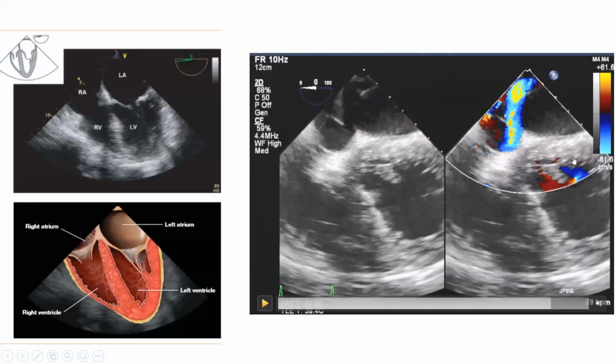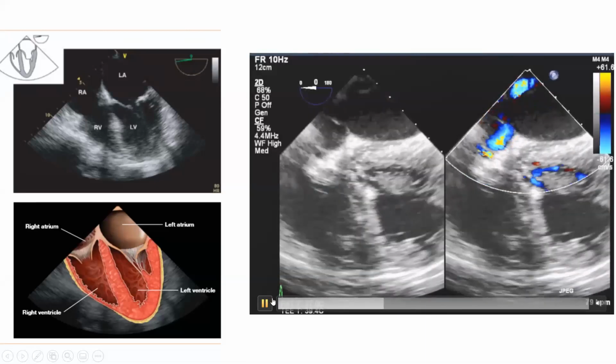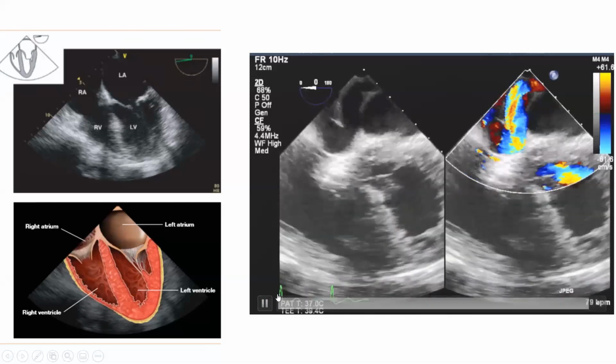So, for example, if I'm assessing the mitral valve, from only mid-esophageal views I can get the pathology. Where is the MR coming from? Is it coming from A1, P1 from the 5 chamber, upper esophageal view? Or if it is A2, P2, it's coming from the mid-esophageal view.